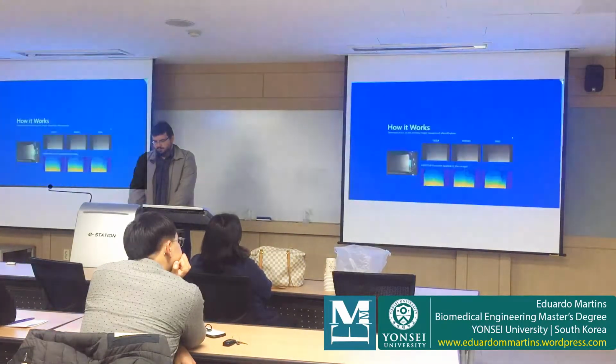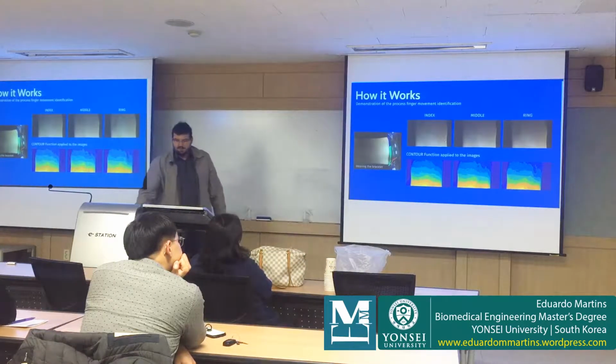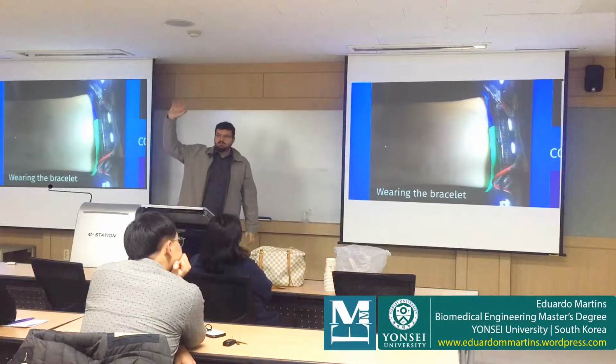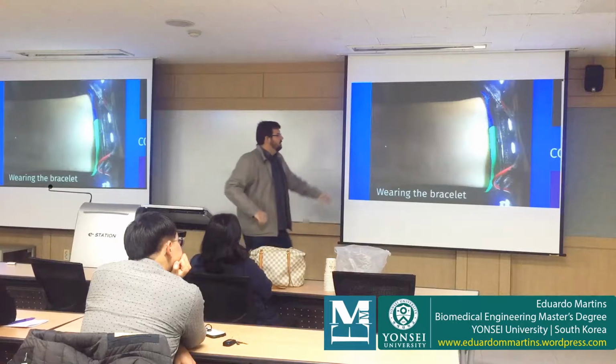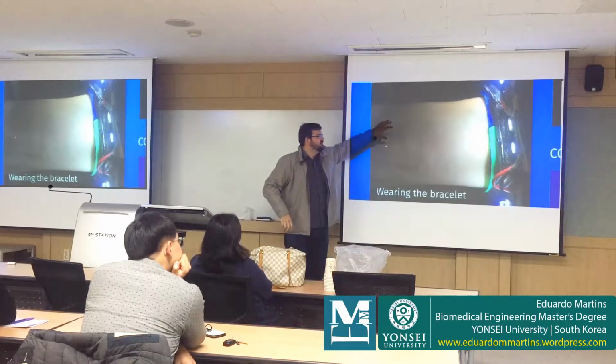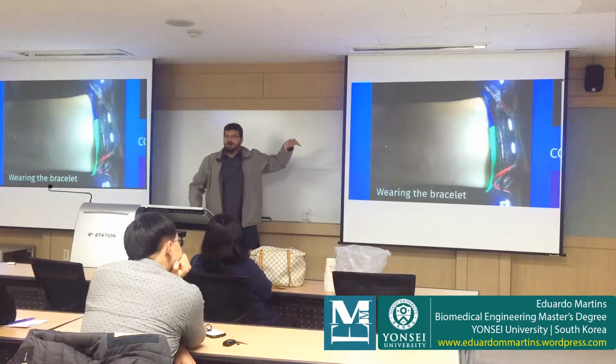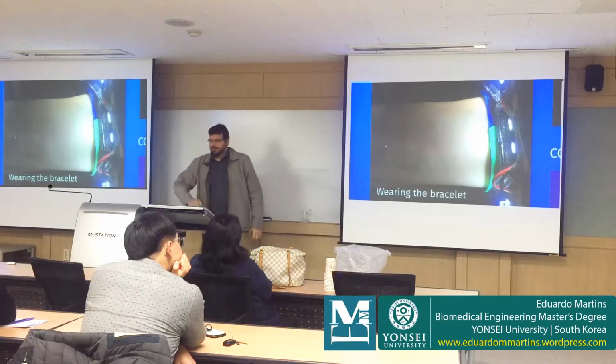So, how it works. Here I have the bracelet on my arm. Every time I move the fingers, this pattern of shadows will change. By this change, I can identify which finger is moving.